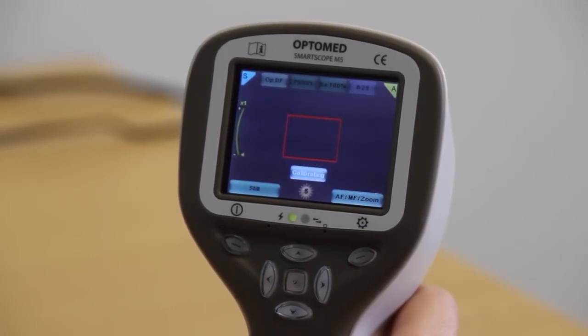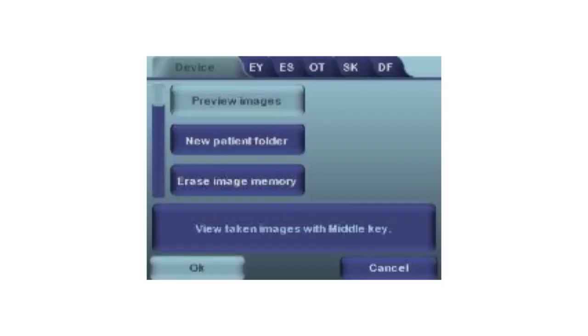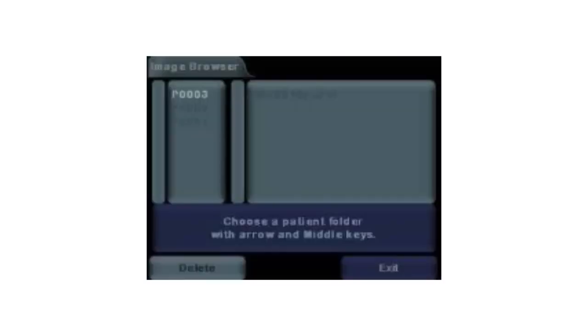If you want to preview images, go to the device menu and select preview images. Note that preview is intended only for a quick reference as the image quality is only thumbnail.